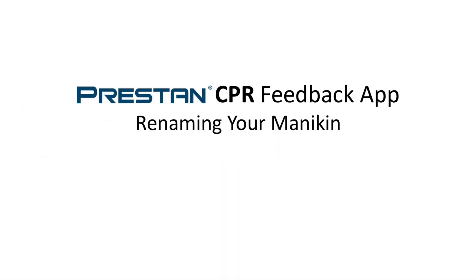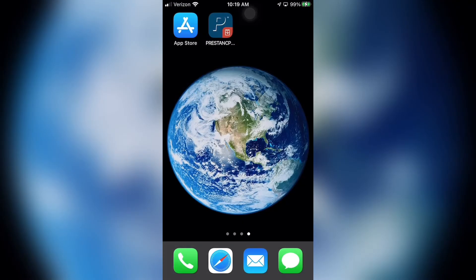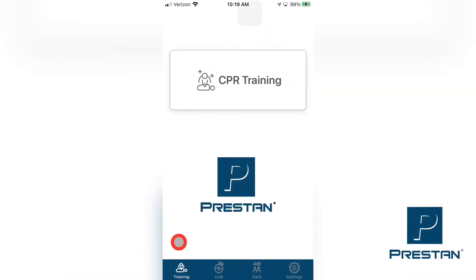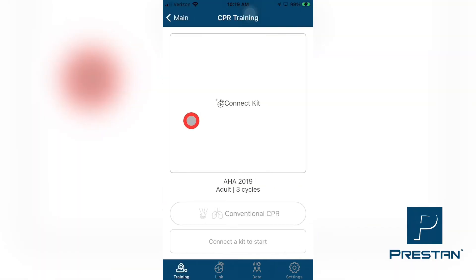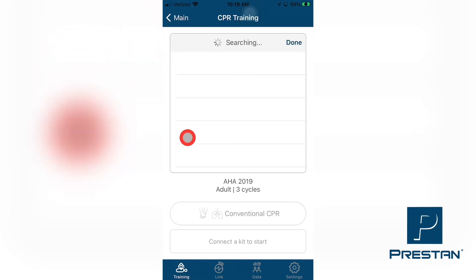Preston CPR Feedback App — Renaming Your Mannequin. The Preston CPR Feedback app gives you the ability to temporarily assign a student's name to the mannequin for a training session. Select the Training tab at the bottom of the screen. Press CPR Training. On the next screen, press Connect Kit. Select any mannequins to connect from the list that appears.